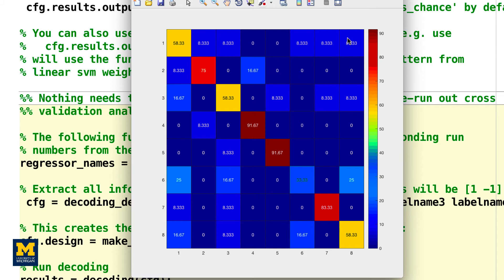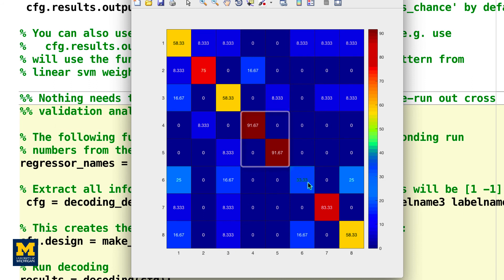How should we interpret this? The number in the upper left corner is 58.33%, meaning that when the classifier was trained with beta maps for the bottle condition, it accurately identified other bottle beta maps (the testing data) 58.33% of the time. The value of 8.33% just to the right means bottle beta maps were misidentified as cat beta maps. A perfect classifier would be 100% on all diagonal squares. Note that the highest classification accuracy is for faces and houses, and the lowest is for scissors, replicating the main findings in the Haxby paper.